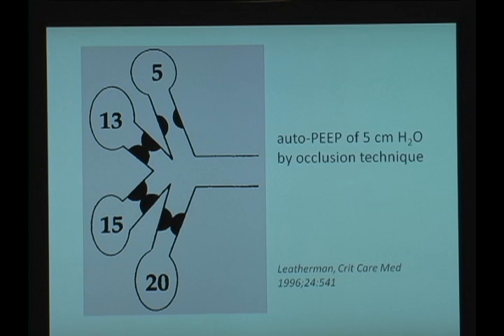Would our graphics still show that they're fully coming back to baseline? On the ventilator? No, it would not. The expiratory flow would not come back to baseline because there'd still be flow coming out of this airway. So that's one of the times when you go more by graphics, or just by clinical presentation.